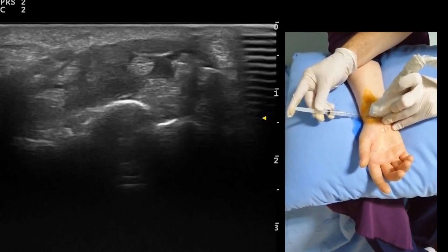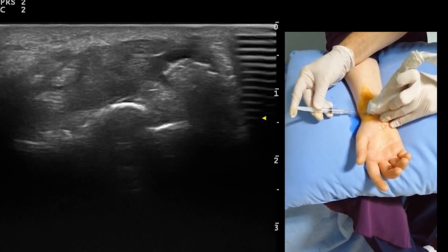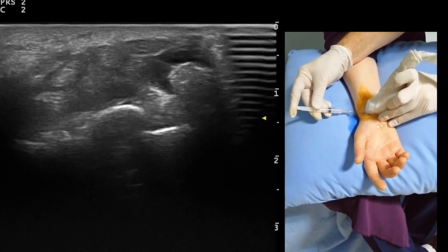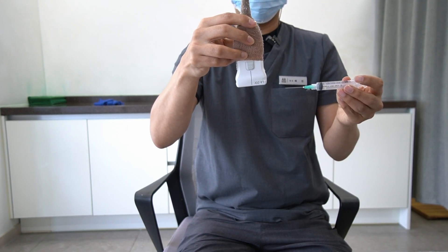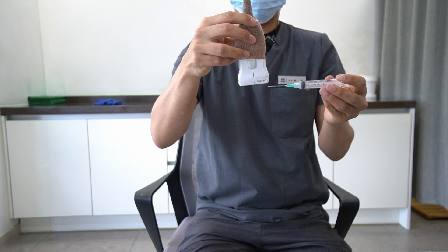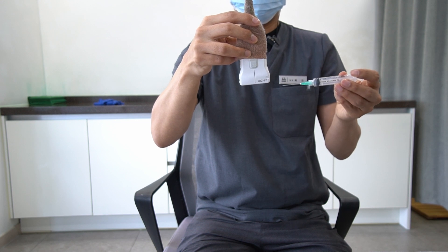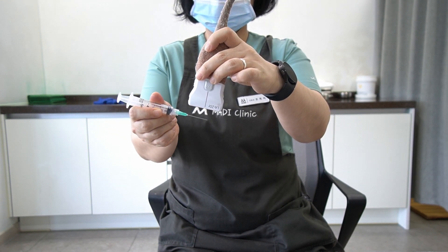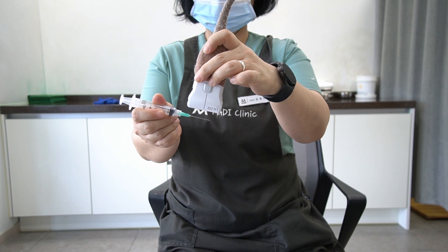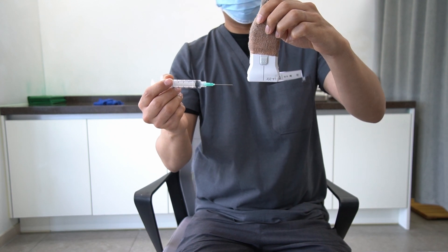Certain doctors, especially right-handed ones, prefer holding the needle in their right hand and the ultrasound probe in their left, moving horizontally from right to left. I have experimented with my team to hold the ultrasound probe and needle in various directions and manners. Please watch the accompanying video and decide which method is the most convenient and accurate for guiding the needle to the correct injection target. I'm deeply grateful to my staff, who are always prepared to assist me.